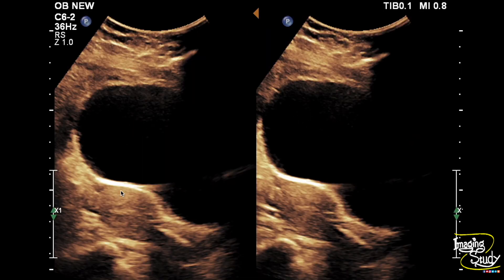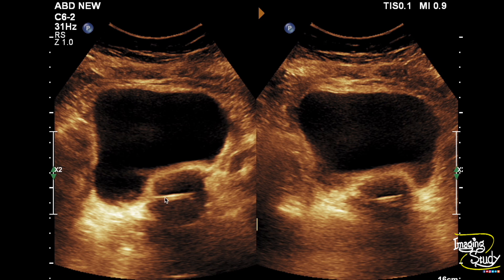Here is the longitudinal section of the uterus. You can see the hyperechogenic linear structure — that is the vertical part of the copper T at the cervical cavity — and it is casting a faint acoustic shadow. On transverse section, you can see the horizontal part embedded into the lower uterine myometrium.